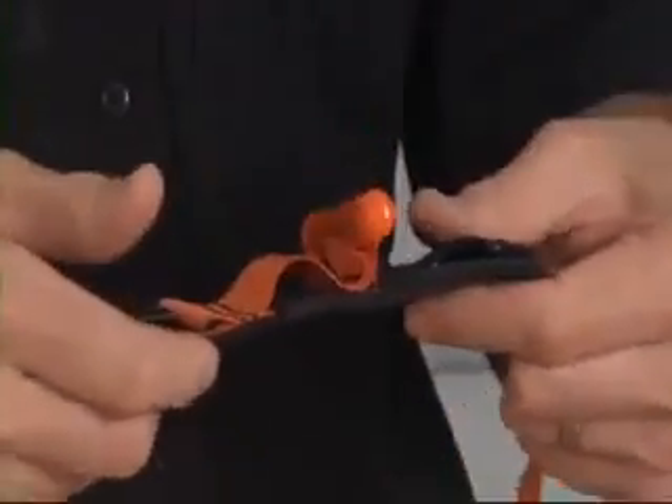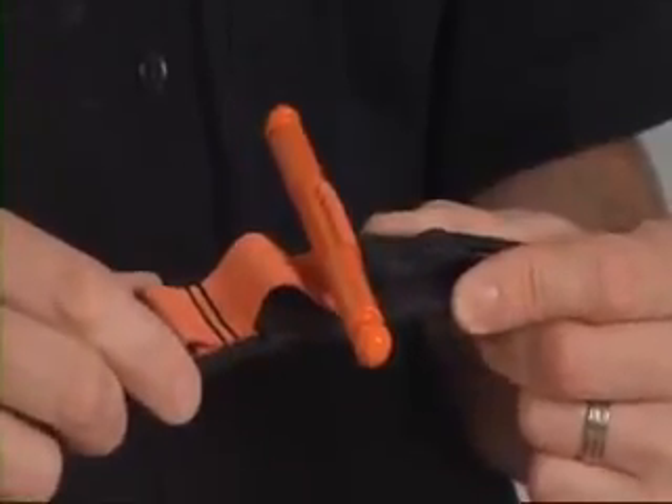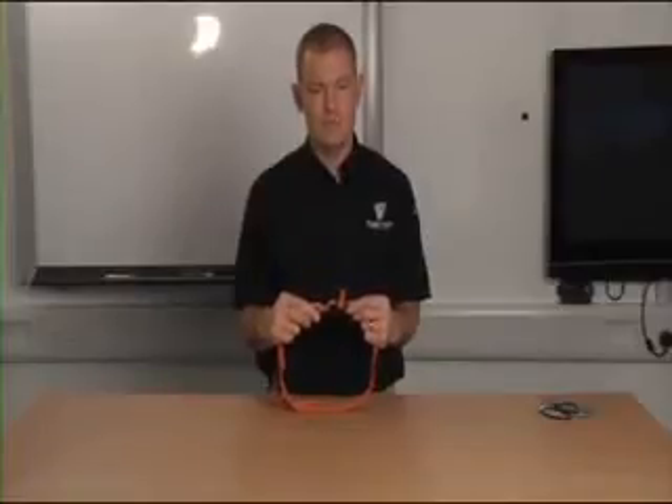When applying any arterial tourniquet at the thigh level, particularly in large adult males, you may find that you need to apply two tourniquets adjacent to each other within two to three centimeters, so that between the two tourniquets you can affect pressure deep enough to actually occlude any arteries and stop the bleeding.